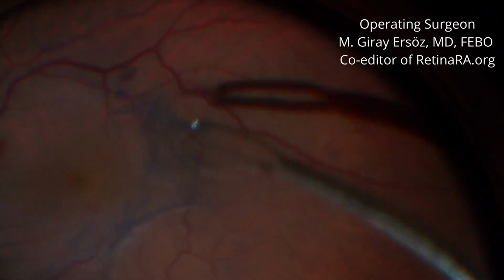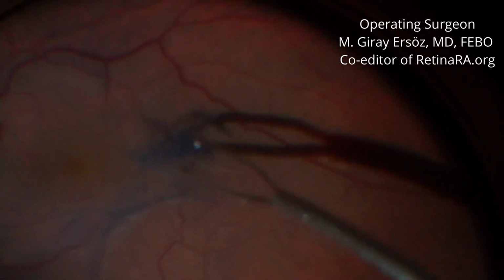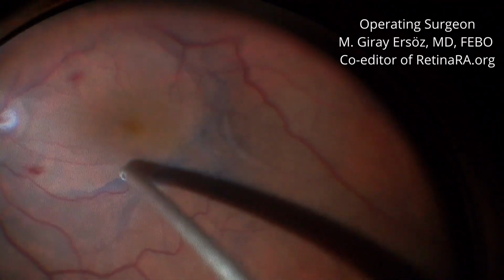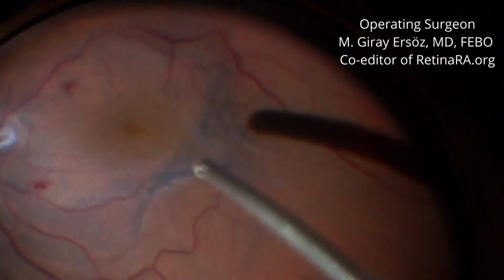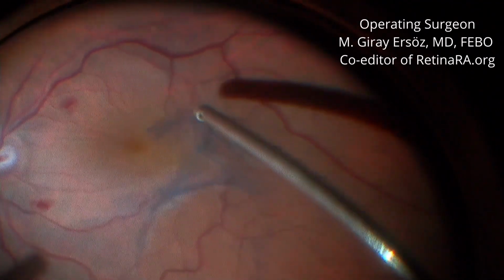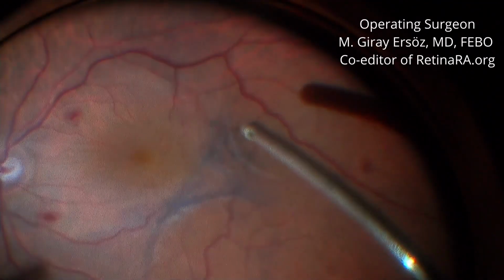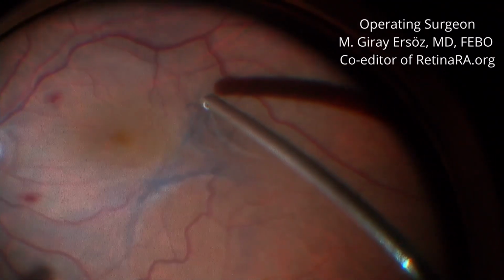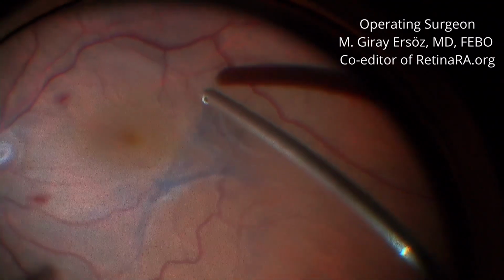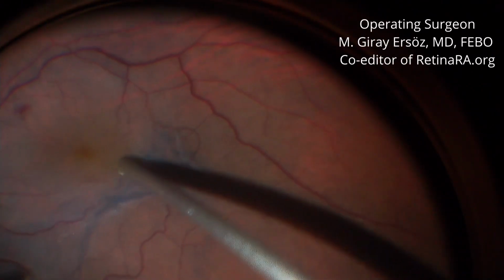Eventually, I discontinued peeling in areas where traction remained too strong. Using the cutter of the 25-gauge vitrectomy probe, I trimmed and relaxed the residual membrane edges, then completed the surgery. Attempting complete membrane removal in severely damaged regions could result in further retinal injury and visual field defects. Moreover, excessive manipulation might provoke more aggressive epiretinal membrane proliferation post-operatively.